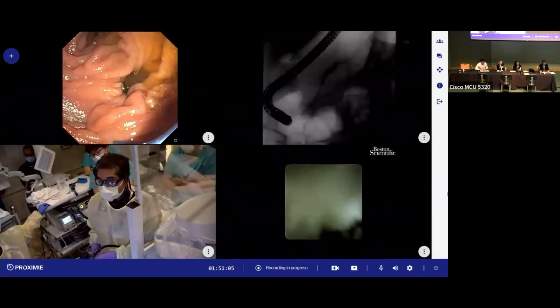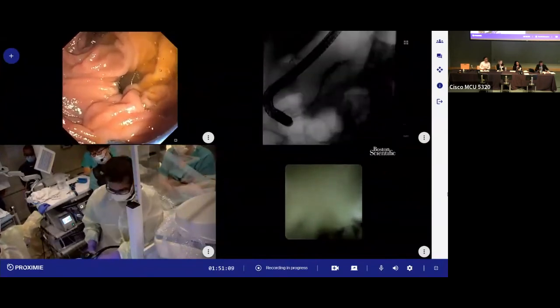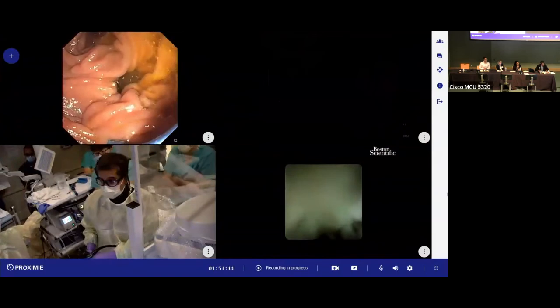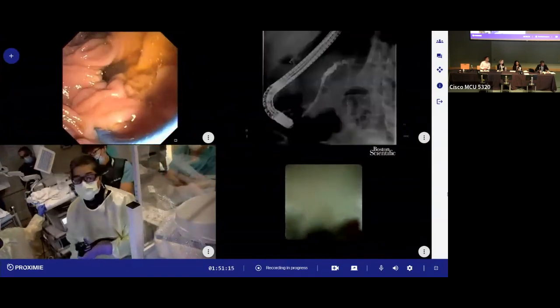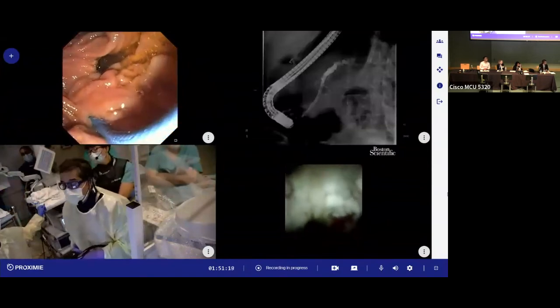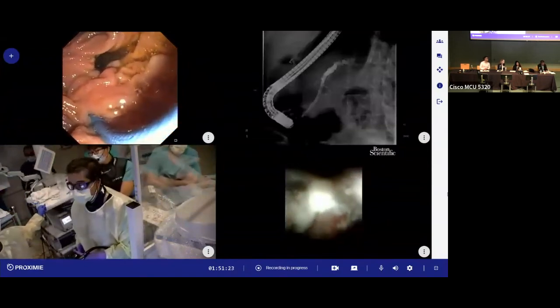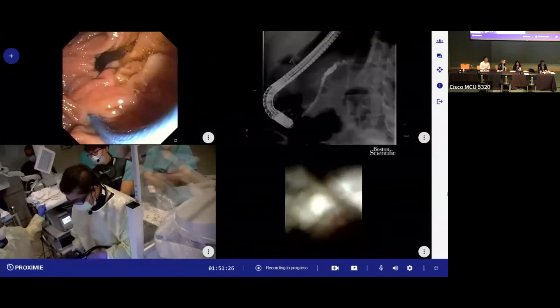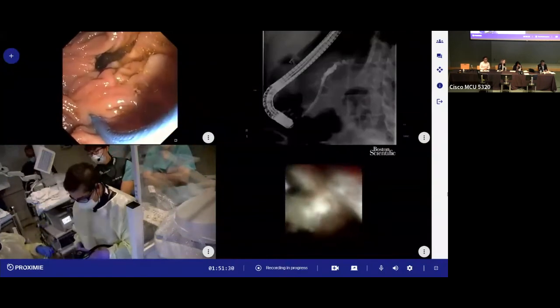There's the upstream duct. Look at that. Yes, stop there. So this is a case where she was already getting some pain improvement with the stenting that wasn't even across the stone. Stop injecting there. And then we can just pass the wire through here, actually. Let's just do that. So take this off. Let's just flush it with saline.